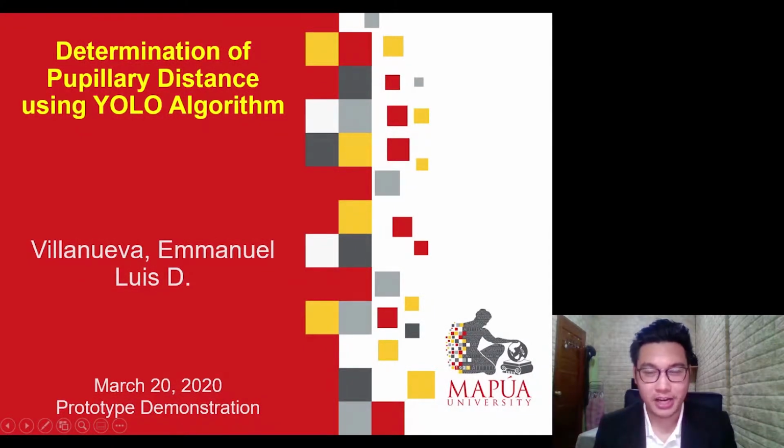Good day. I am Emmanuel Villanueva, and I am here to demonstrate the prototype model that has been created for the study, determination of pupillary distance using YOLO algorithm.